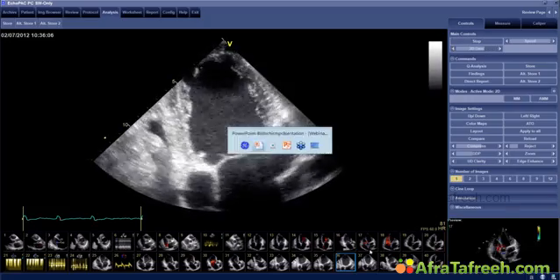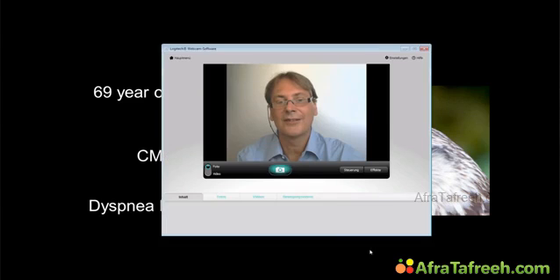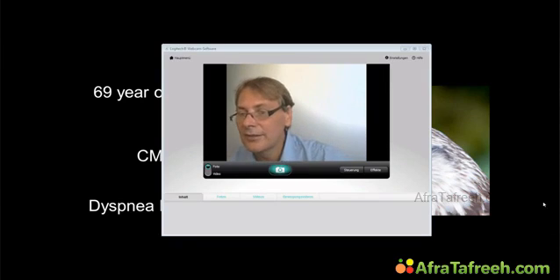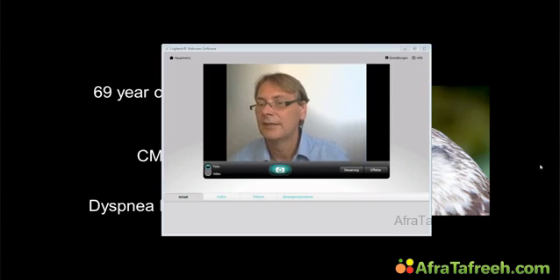Now it's your turn to answer a question. Okay, you ready? Here we are, questions.